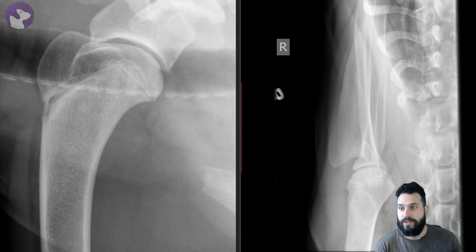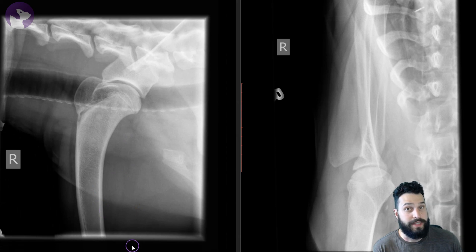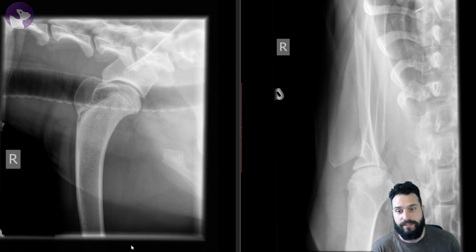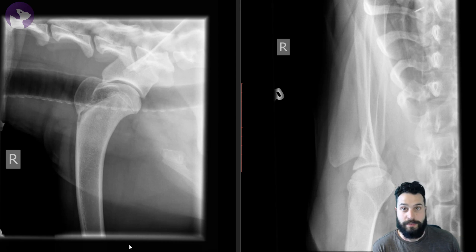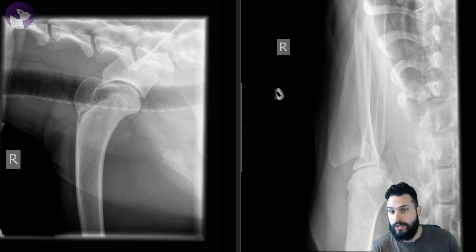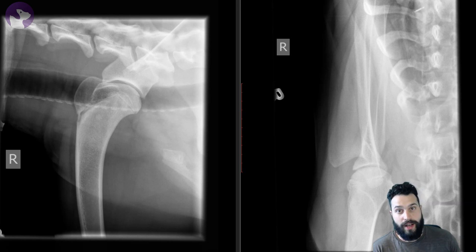Even if the patient's not lame, this could still be a bilateral problem, so we want to make sure we take radiographs of the other limb just to be sure. Other things to think about in a young dog would be panosteitis, which we don't see any evidence of here, and of course fractures, infections, physitis, or other types of septic arthritis. This patient was diagnosed with OCD and did quite well. I hope this has been helpful in evaluating shoulder radiographs in your practice.